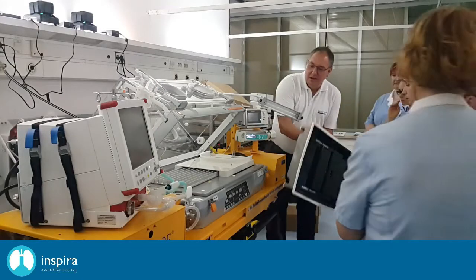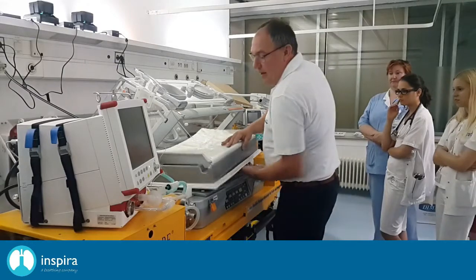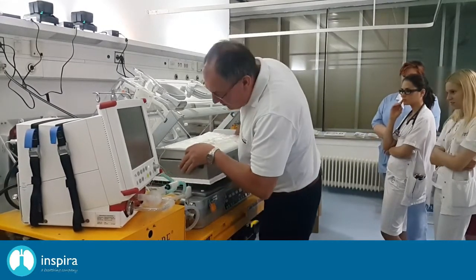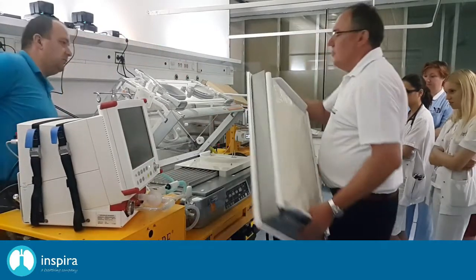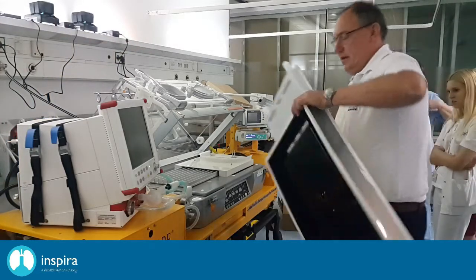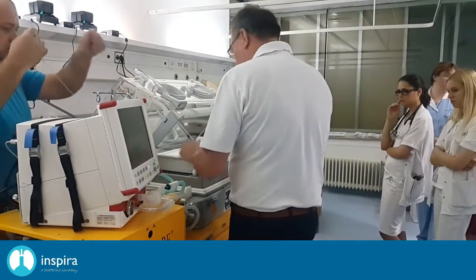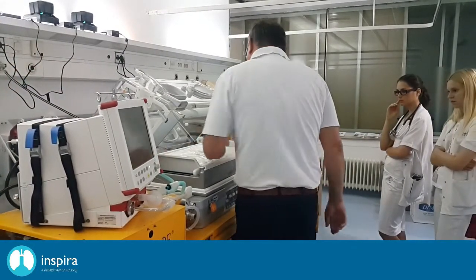Good. Okay, so then we close it again. Ah no, stay here again. If you have an emergency on the baby, you can see it. Something is wrong. Turn it around? No. Yeah. Now it's okay. So then you can pull it really hard here and look if it's okay.